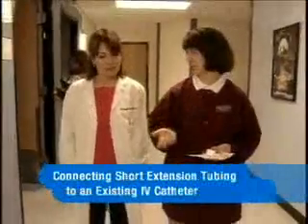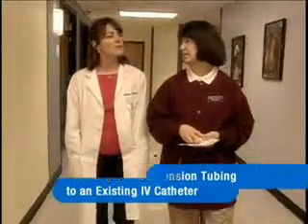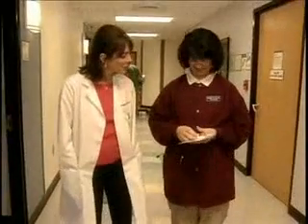Well, I need to cap my patient's IV line, but when I was caring for her earlier, I noticed that the IV tubing is connected directly into her catheter hub. Well, this would be a good opportunity to connect short extension tubing to the IV catheter to minimize future blood exposure. Can you observe? Of course. Looks like you've got your supplies, so let's go to the patient's room.